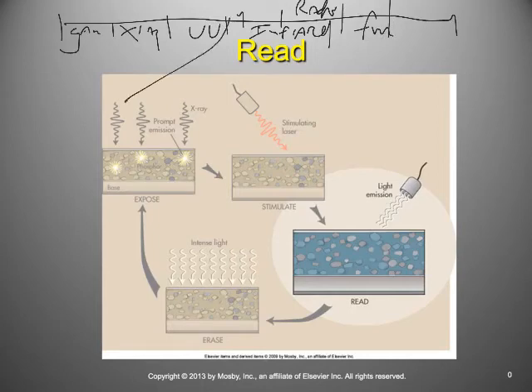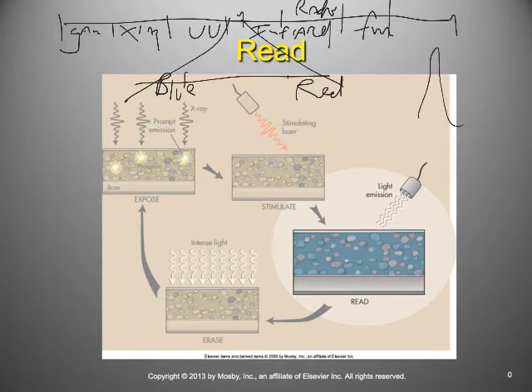In this region here of visible light, which is what's occurring inside of a CR reader, over here we have the red, so bigger wavelength, and over here we have the blue. And this is important because the laser has what we call a discrete wavelength. It does not vary. It's not a spectrum. It is just a laser, period. It's the color of red that it will always be when you give it a certain amount of electricity. So it's what we call discrete. It has a peak to it, and it's a very narrow peak.